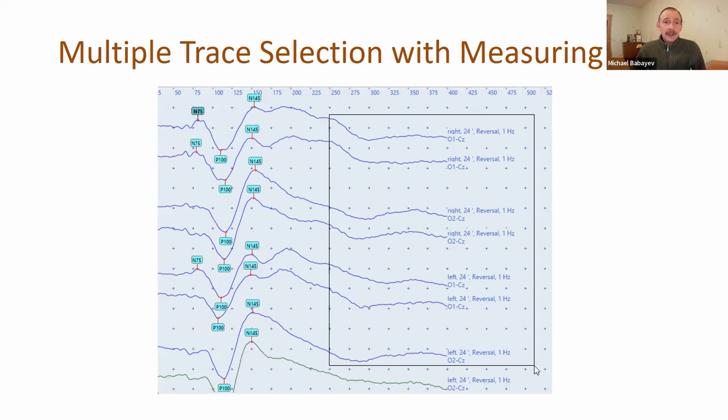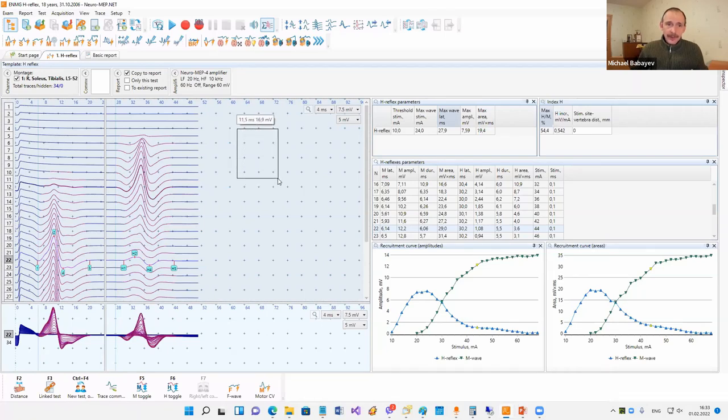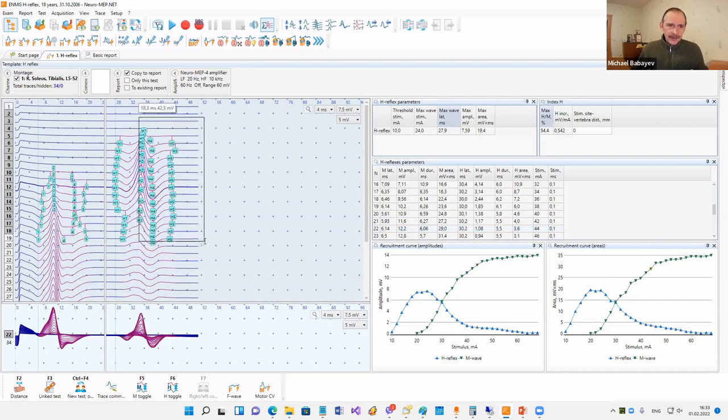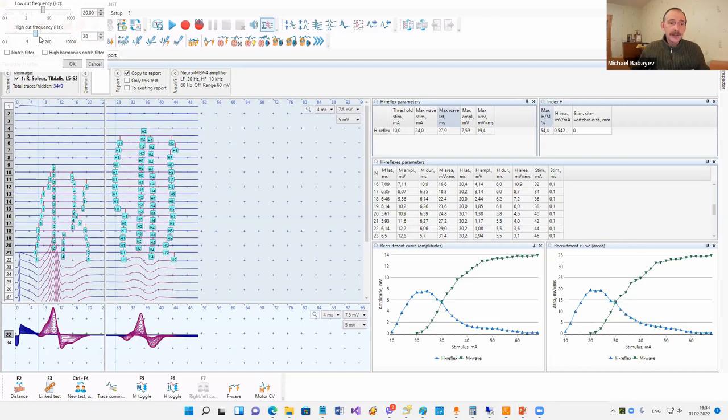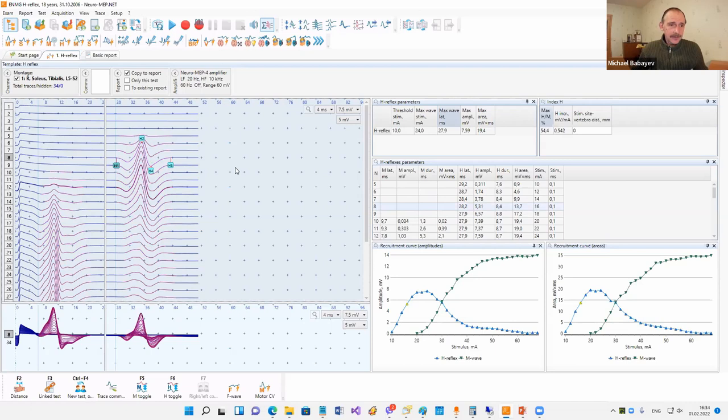Now it's possible to make multiple trace selection with a measuring rectangle. With this rectangle it's possible to make fast measurements of intervals and amplitudes - press Shift, then hold the left mouse button and drag. Now when you drag the mouse on screen, you will select all traces inside this measuring rectangle. You can then apply group operations to these traces - for example, filtering all traces at the same time, or deleting or hiding all selected traces.